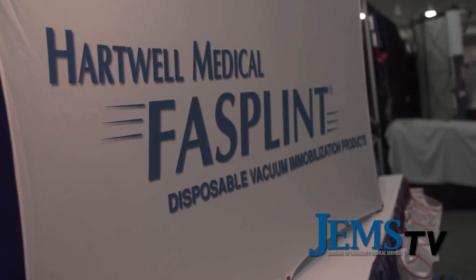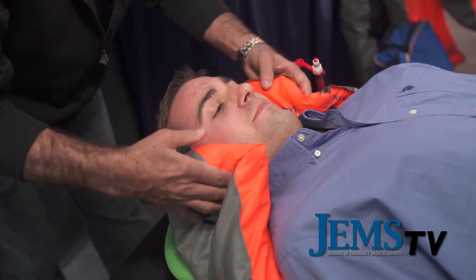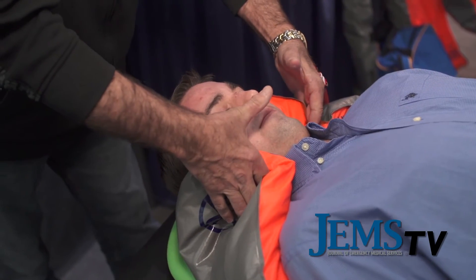Tell us what else you're showing off this year. The Fasplint Full Body is one of our more economical vacuum immobilization devices, and we also have a newer version called the Halfback, which is about half that size — designed for fire departments that have very limited storage space.